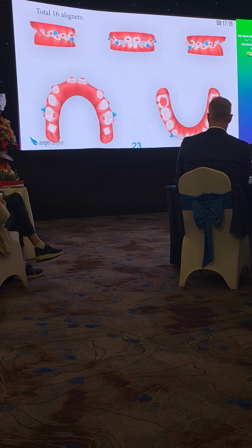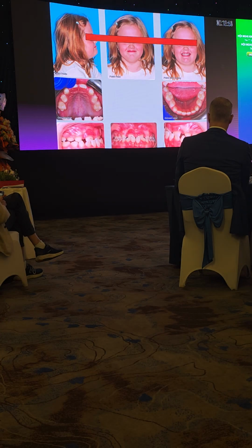So obviously, there are 2 things you can do. One is to increase the trim line. All right, you understand what the trim line is? How much it covers, all the way to the gingiva. So don't stop at the gingival margin. Okay, go further up. So you get some retention, because we are going to do protraction and also class 3 elastics during the daytime. So this is Patricia, okay?